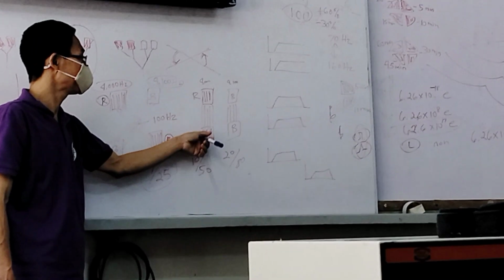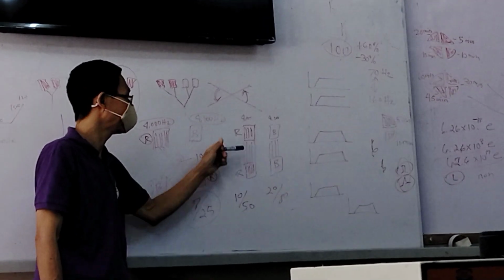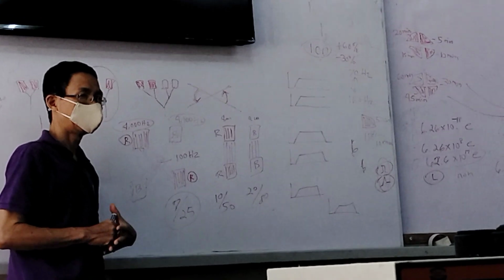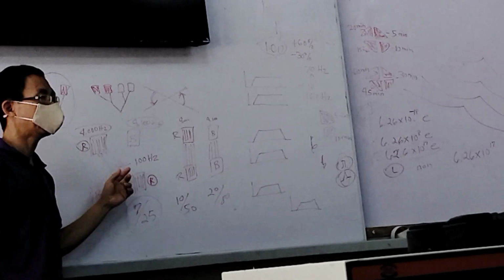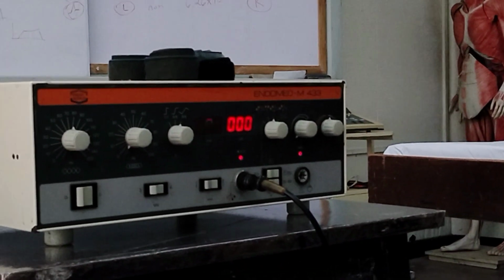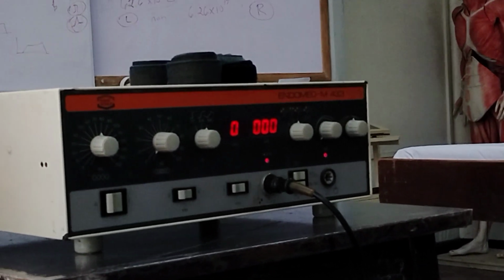Therefore, what you are producing is still just a medium frequency current. No resultant frequency is produced in this arrangement. That's why you have to position them so the currents cross. It's not that easy to position those four electrodes. That's one of the problems.